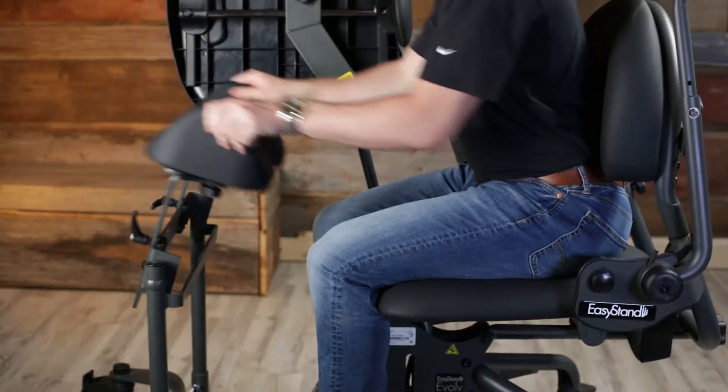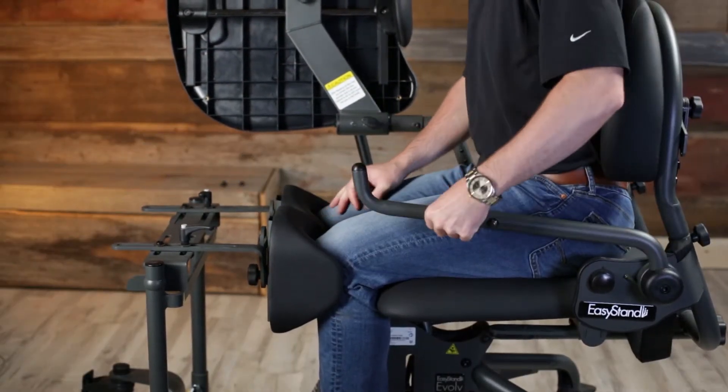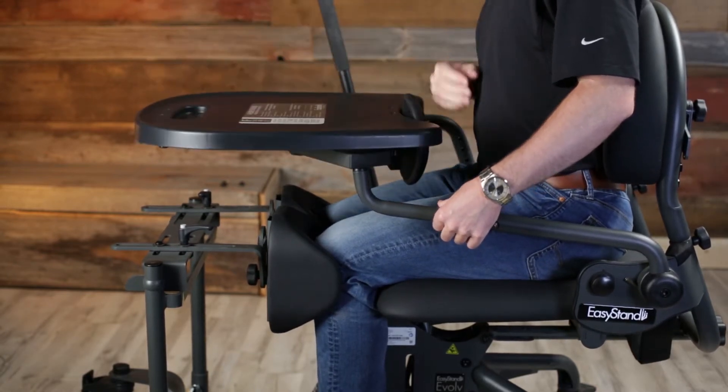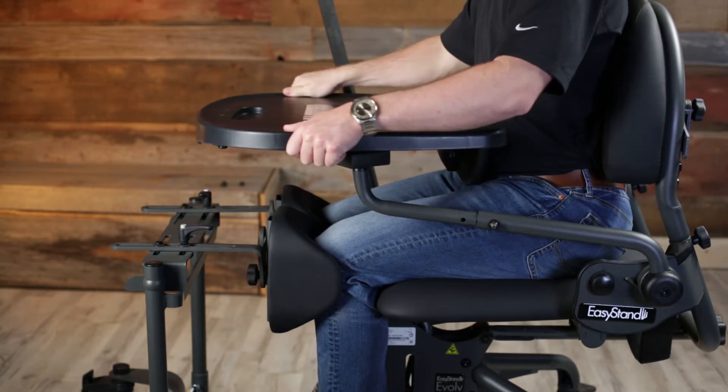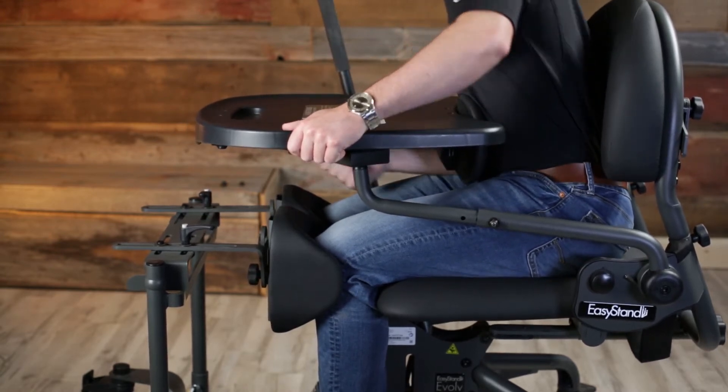With the newly designed adjustable shadow tray, the EZ-Stand Evolve is even more modular and customizable. The adjustable shadow tray is exclusive to EZ-Stand products and provides constant anterior support by shadowing an individual throughout the sit-to-stand transition.